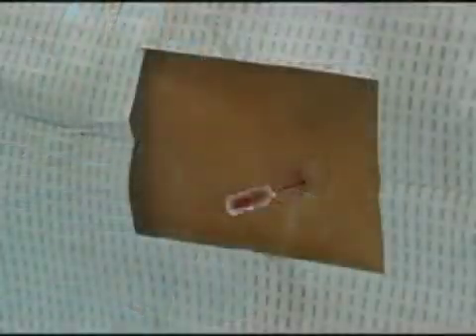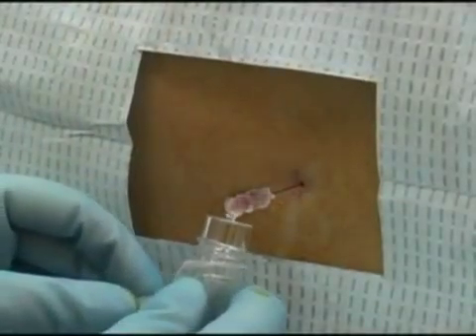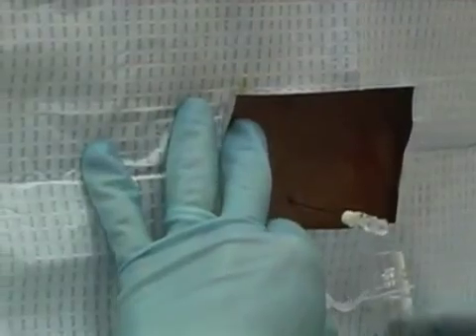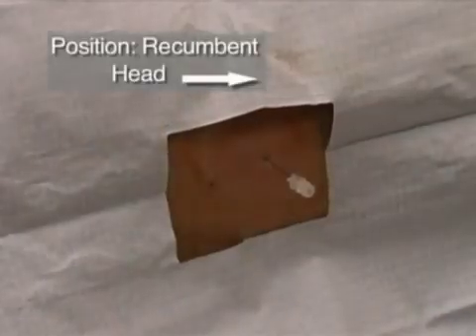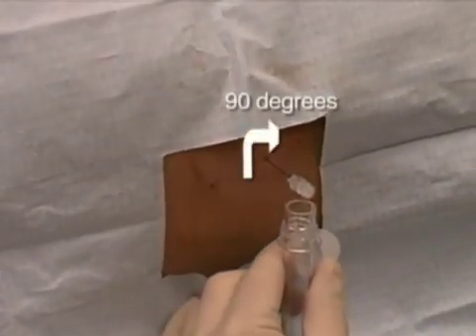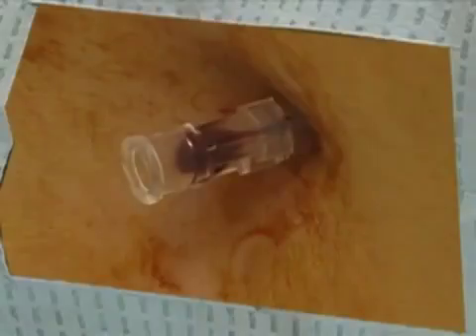Fluid will flow once the needle enters the subarachnoid space. If the lumbar puncture is traumatic, the cerebrospinal fluid may be tinged with blood. As additional fluid accumulates in the barrel, the fluid should become clear, unless the source of the blood is a subarachnoid hemorrhage. If the flow is poor, a nerve root may be obstructing the opening of the needle, and you should rotate the needle 90 degrees. If drops of blood enter the needle, it may become clogged.